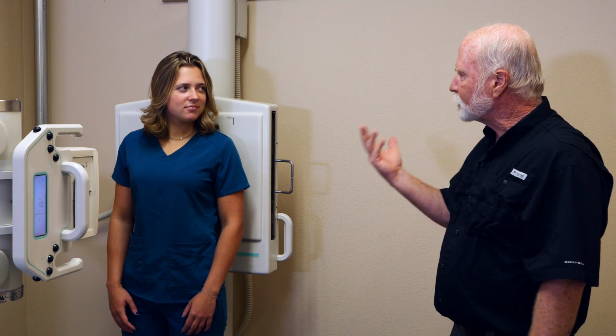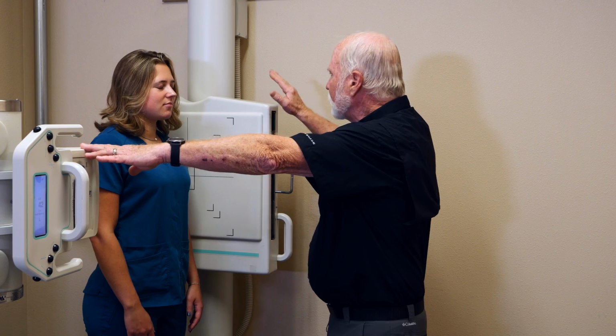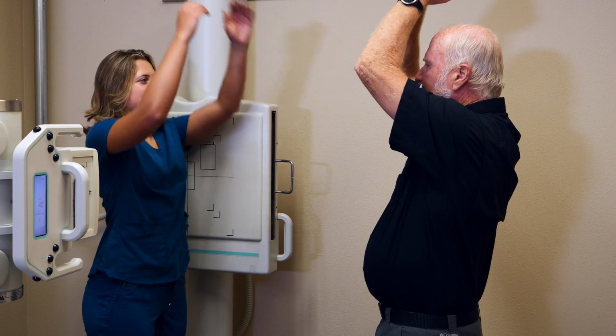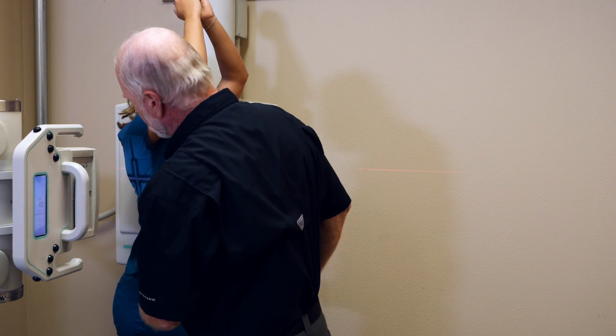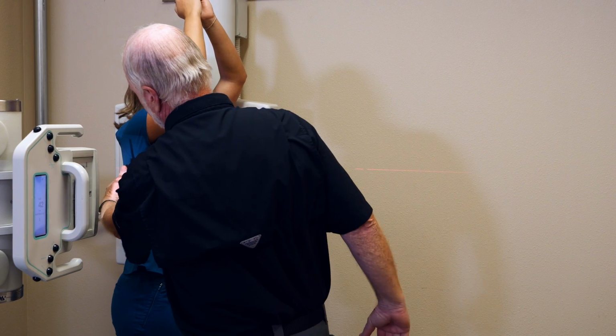For lateral, I'm going to have her turn towards me. I'm not going to mess with my tube or my IR because I'm pretty sure she didn't get taller or shorter between the first exposure and the second exposure. Have her raise both arms up above her head. Have her step over to the IR and come about a half step towards me. Good. I'll look here, make sure I've got one there. Looks like she's lateral.